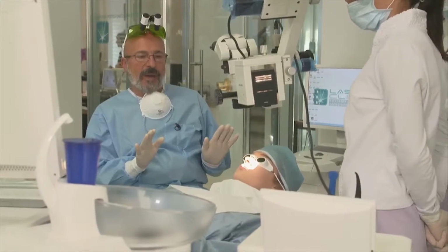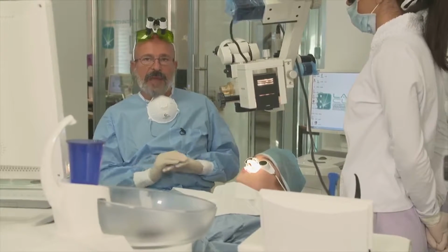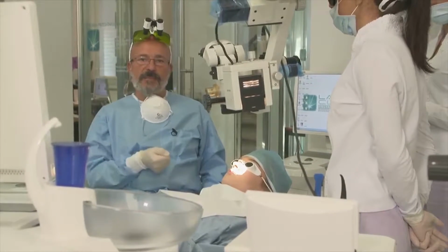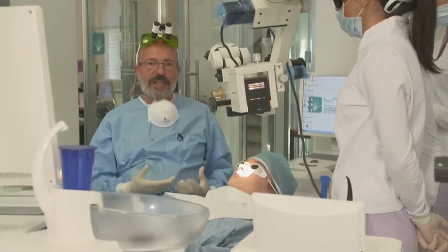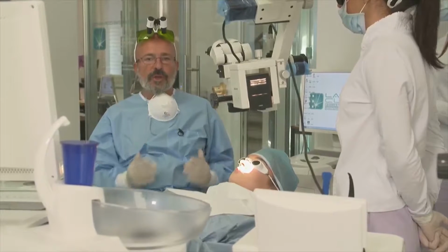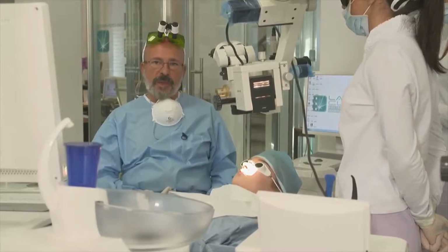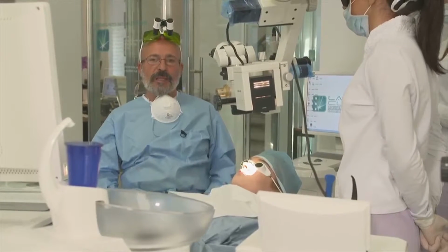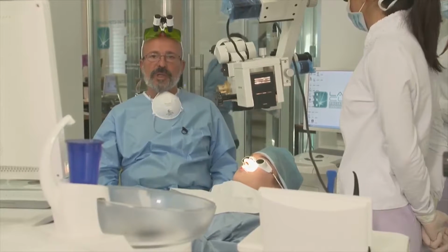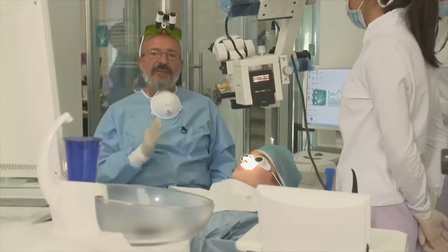Yesterday we spoke about the difference between electrosurgery and laser. They are totally different. Using electrosurgery, you use a flame in the oral cavity. You use energy that is given to the target tissue, but also to the surrounding tissue. So when we are in front of a thin biotype, we can cause great damage, and there is a great possibility of retraction of the gingival contour after a procedure using an electrosurgery device. Instead, the laser is very, very selective.